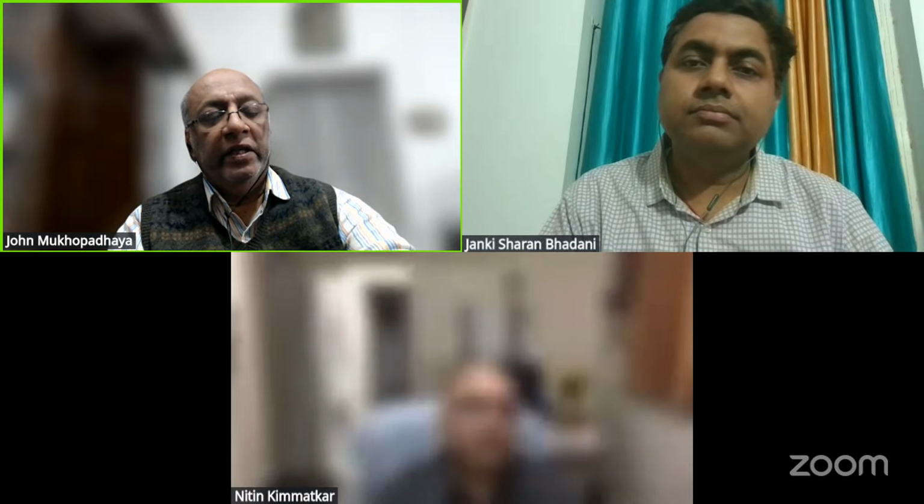Thank you very much, Nitin, for a very nice presentation showing the importance of analyzing the fractures on CT scans and also the stability and reduction, emphasizing the importance of good reduction and good stability of the fixation. I think the device you've used is the angle blade plate. There are various other devices you can use, but the importance of reduction and the stability of the fracture reduction remains most important in the management of these fractures.